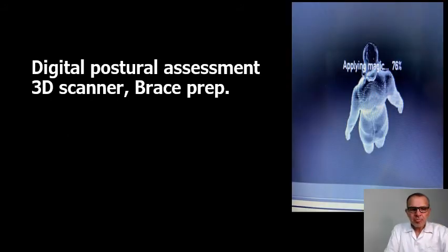Then we have another very good tool, the digital postural assessment, the 3D scanner. It's software hooked to the iPad, and we scan the patient in a certain way with a certain technique, and it's simple and easy to learn. This helps us a lot in brace preparation, and when we prescribe exercise to follow up.